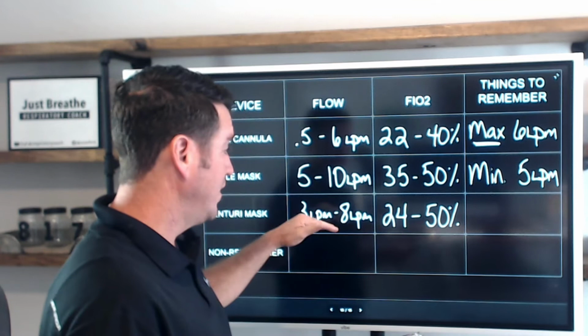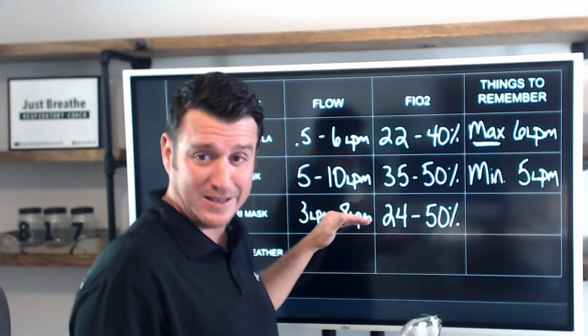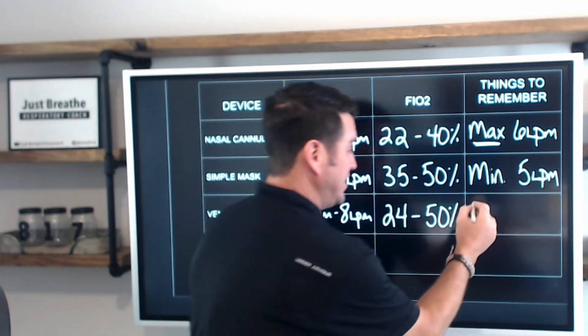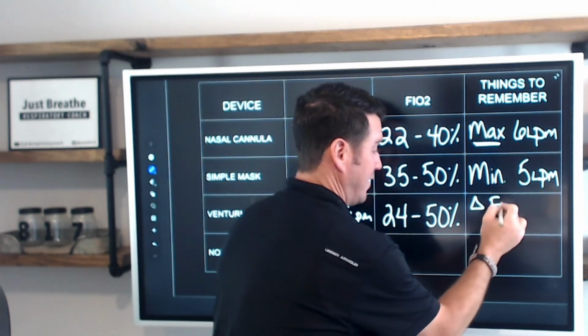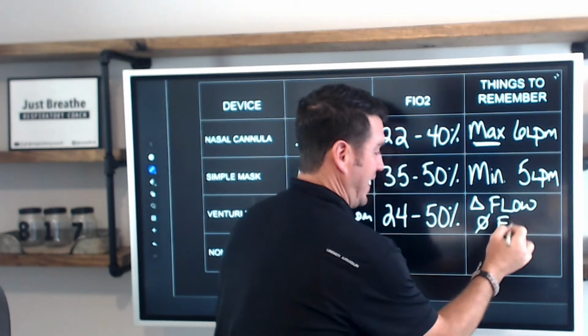So that's your flow. The thing to remember about the Venturi mask is that changing flow does not change FiO2.